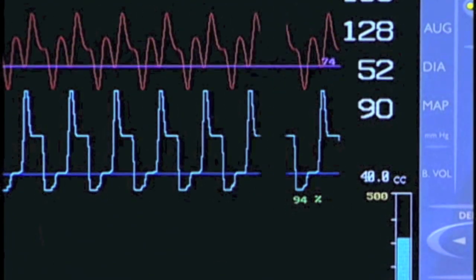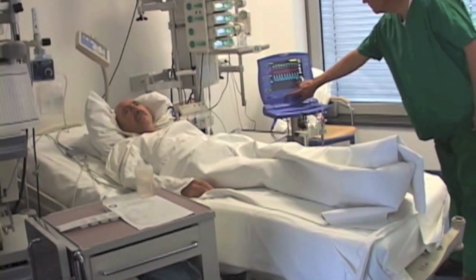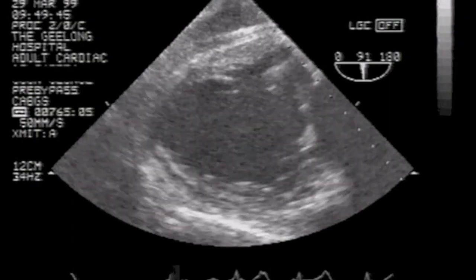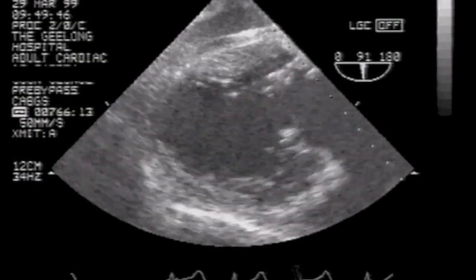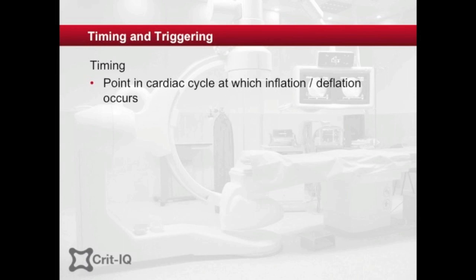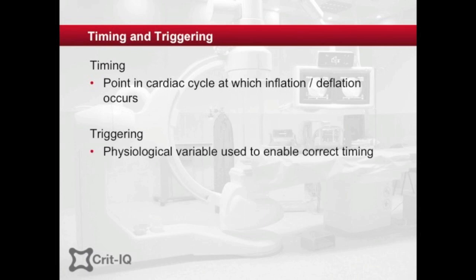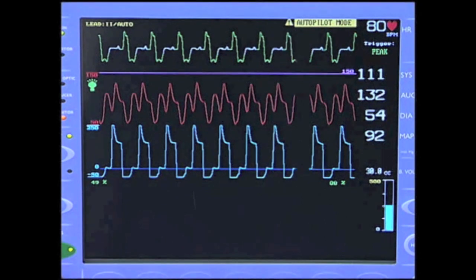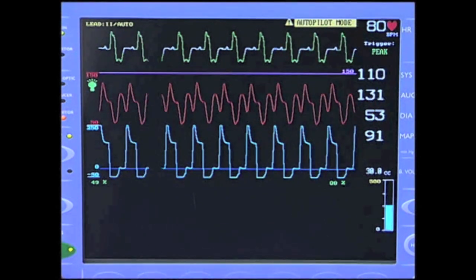Modern intra-aortic balloon pump technology has improved to such an extent that timing and triggering are automatically adjusted in response to changes in patient heart rate and rhythm. However, an understanding of these concepts remains important. Timing refers to the inflation and deflation of the balloon in relation to the patient's cardiac cycle. Trigger is the physiological signal from the patient that identifies the beginning of a new cardiac cycle. This triggering event is best sourced from the ECG, the R-wave representing the onset of a new cardiac cycle.